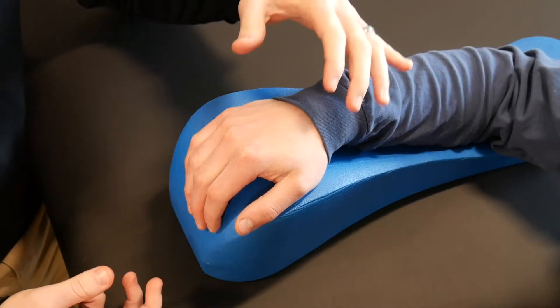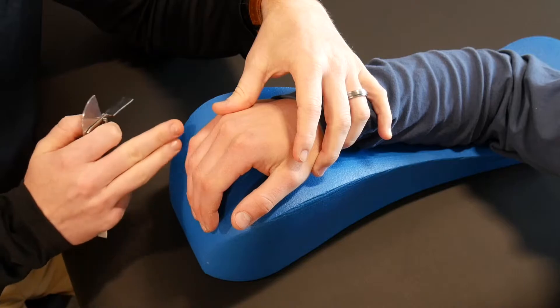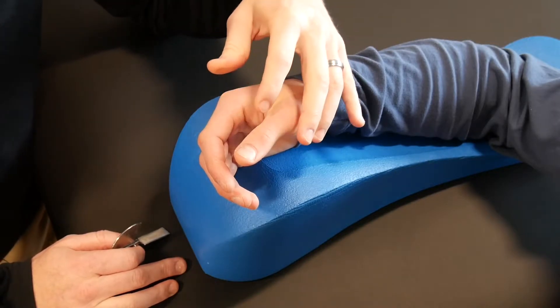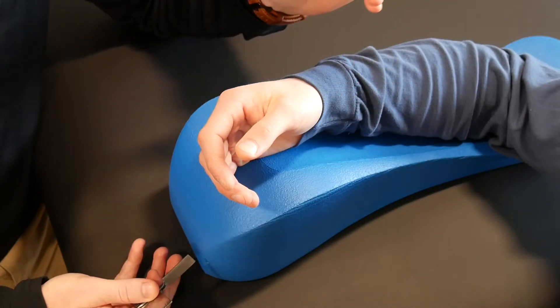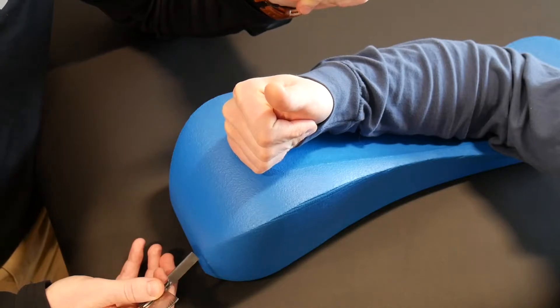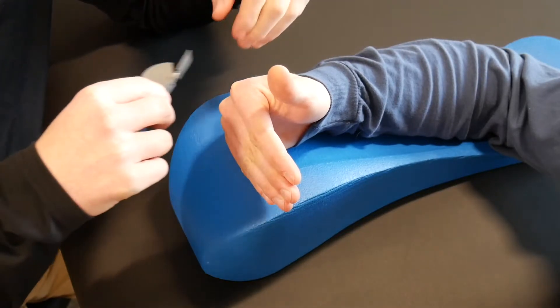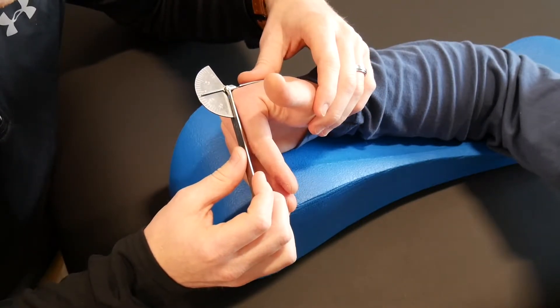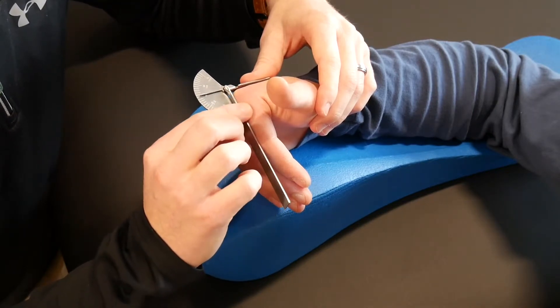I'm just going to take you through a few measurements. Specifically, we're just going to look at the index finger today — of course all of this will apply to digits two through five. In the finger you've got three joints. We're going to start with the MP or MCP first. For an active measurement of that joint, I'm going to ask the patient to come down and flex as far as they can. You're going to lay the goniometer right on the back, or the dorsum, of the second metacarpal, and lay the movable end of the goniometer right across the proximal phalanx.